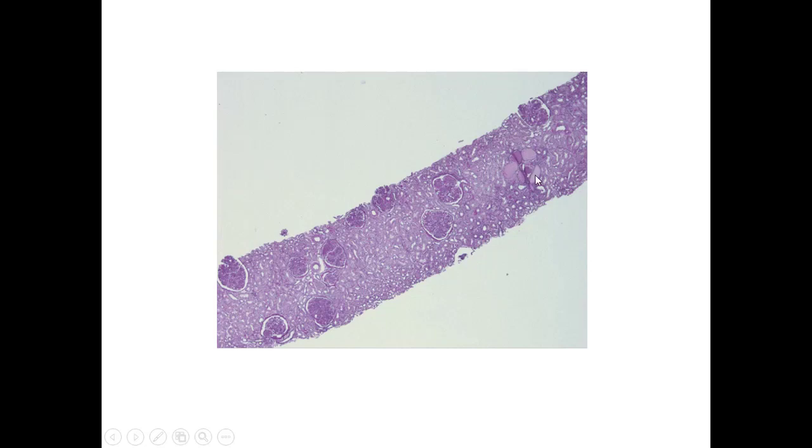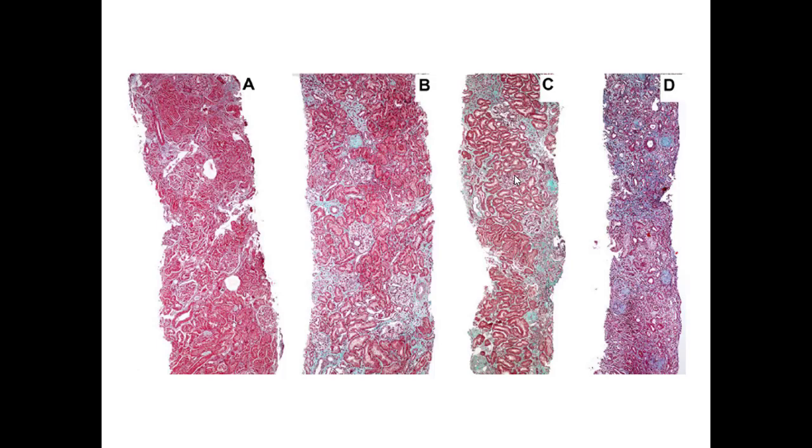I cannot see any histology of the glomerulus, not like this, not like this. Here I see dots of the nuclei, but here no, just eosinophilic material. So it's globally sclerotic, but is the change focal or diffuse? It's very, very focal. So from the low power, I can describe the pathology.